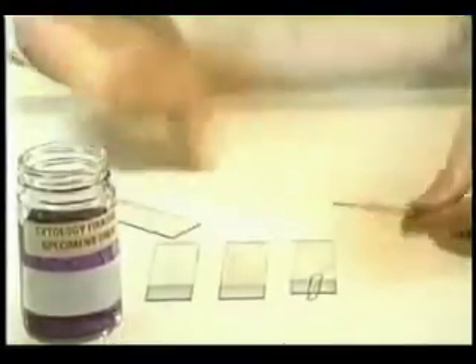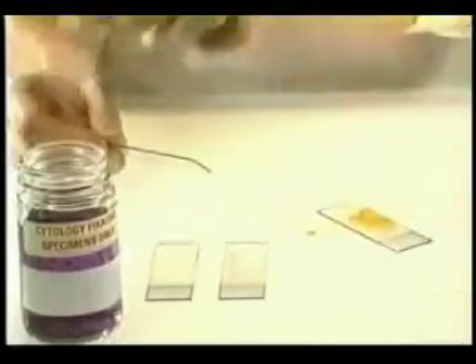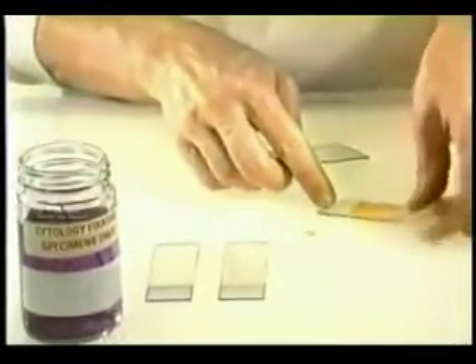In this case, the second sample contains a fair amount of blood. Here, I use a combination of the first two concentration techniques described earlier.